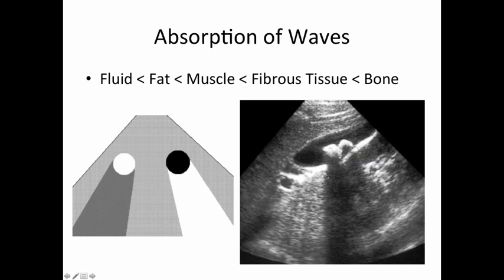While it's dark here, that doesn't mean that there's actually any difference in the liver between the left side of the screen and the middle of the screen. It's just that the waves are reflected back to you. This is similar to what we see in thoracic imaging when you see rib shadows. The ribs will reflect everything back, and so you'll see shadow behind them. It's important to recognize that as not being hypoechoic fluid, but really just the shadowing, so that you can differentiate the two.